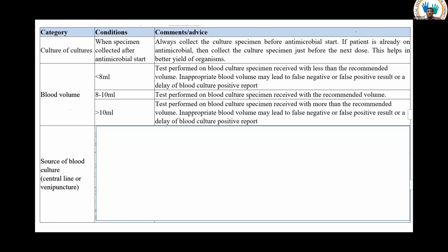Blood volume, our own experience: we have started reporting blood volume in the report form from 2017 onwards. I mean, before this software also we used to report the blood volume to the clinician. I think Deepasri has started this. So when we mention the blood volume, if it is less than 8 ml, then we mention that the test is performed on less than recommended volume. Therefore you should not rely on this report, because our report may be false negative or false positive, because you have not given us adequate blood volume.